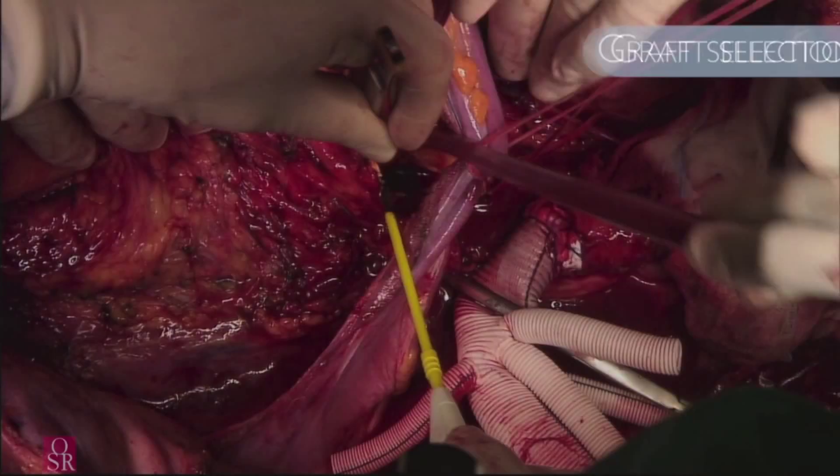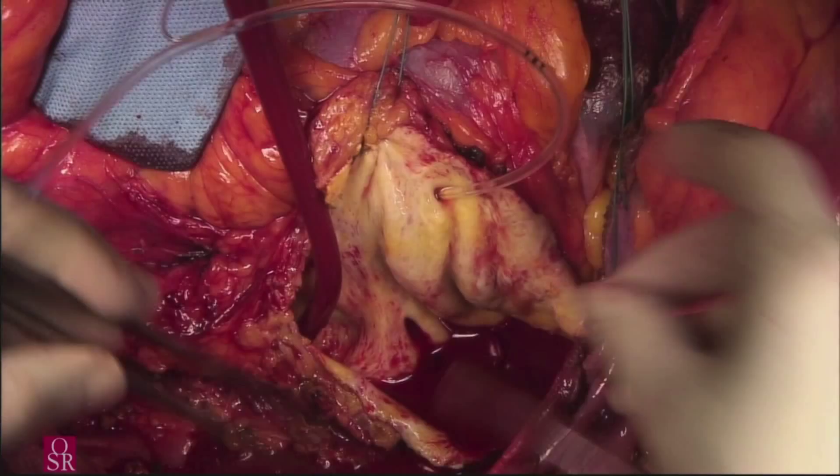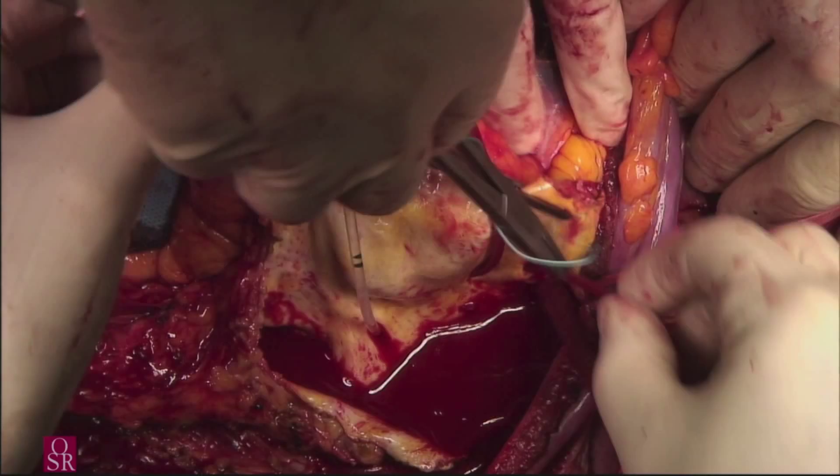The re-implantation of a large amount of native aorta and the inclusion technique for TAA repair carries the risk for subsequent recurrent aneurysm formation.